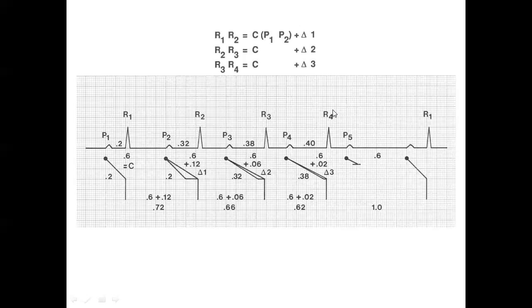So this is one typical example of an AV Wenckebach phenomenon. The PR interval progressively lengthens, then it's blocked. The lengthening of the PR interval is gradually decreasing. Lengthening is most between the first and second, the delta 1.